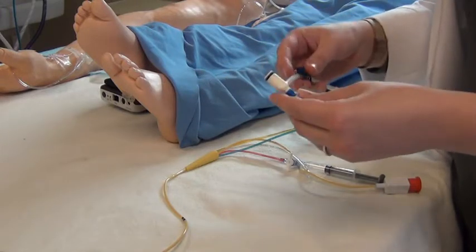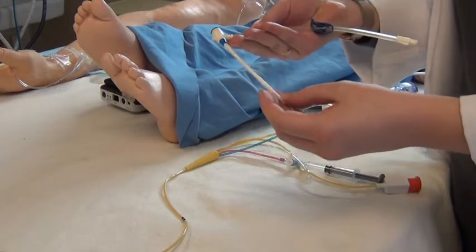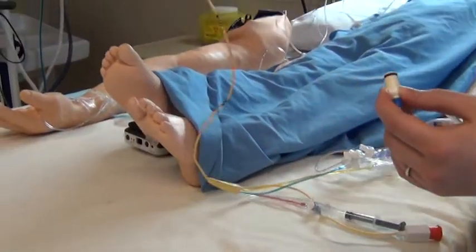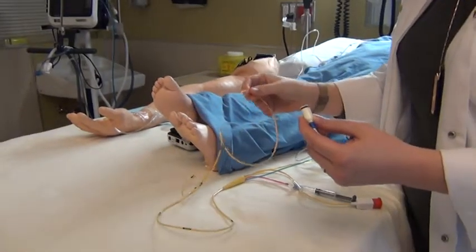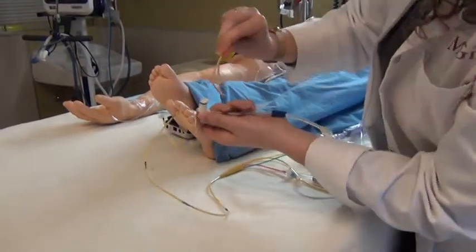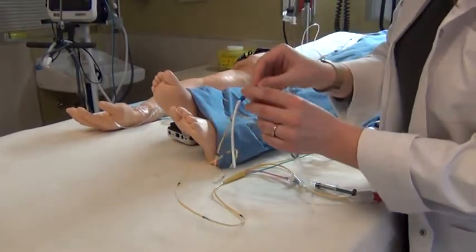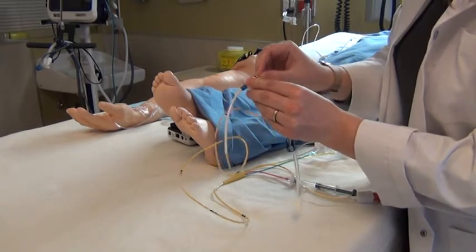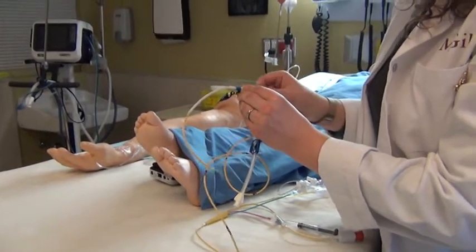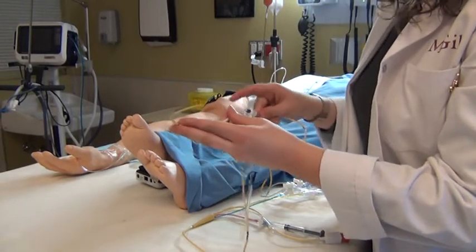A pulmonary artery catheter has to be fished through a Cordis — this is called a Cordis, it's a central line, a single-lumen central catheter. The pulmonary artery catheter, also called a Swan-Ganz, is inserted into this Cordis. Physicians will fish this device through the heart: through the right atrium, the right ventricle, and the tip will end up all the way into the pulmonary artery.